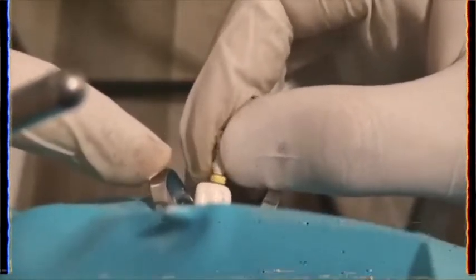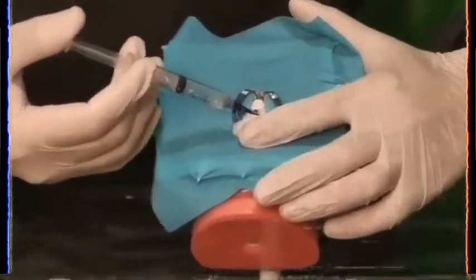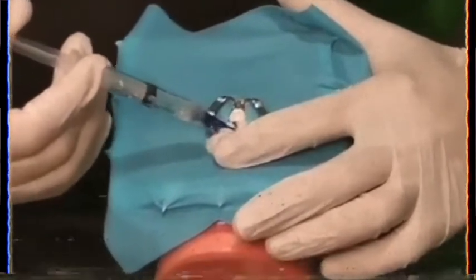Remember, when succeeding to the next file size, remember to irrigate the canal with sodium hypochlorite to avoid accumulation of dentinal mud.